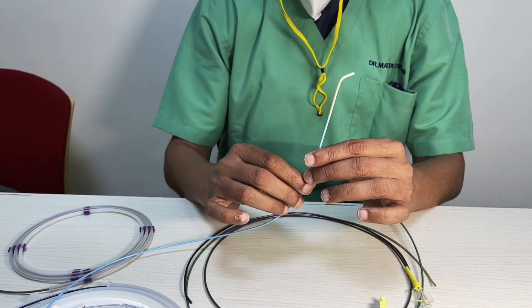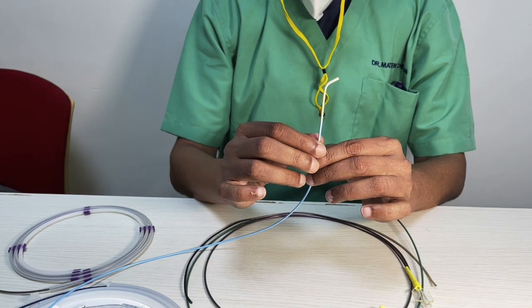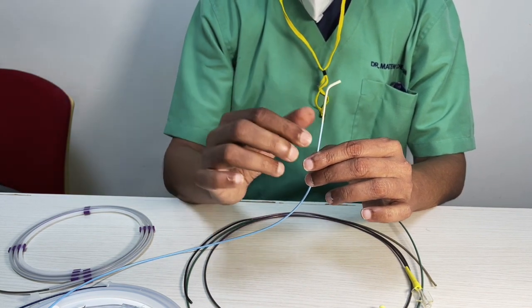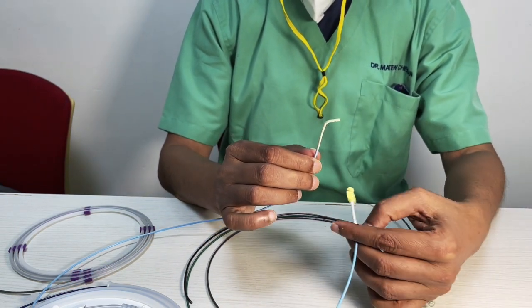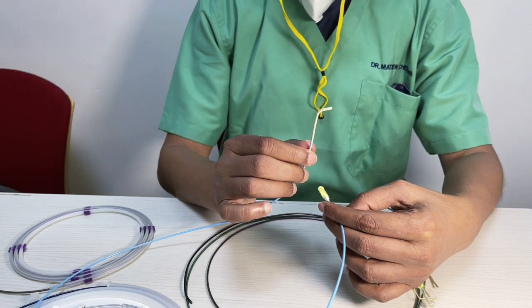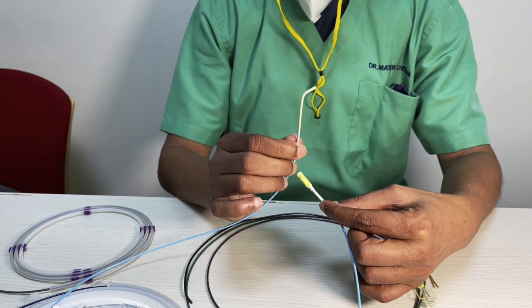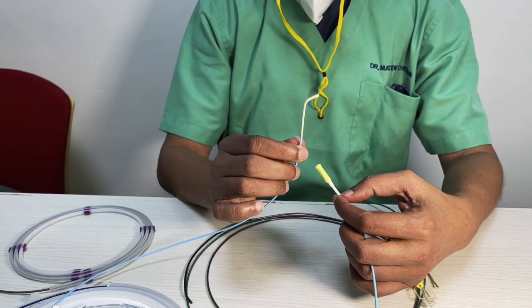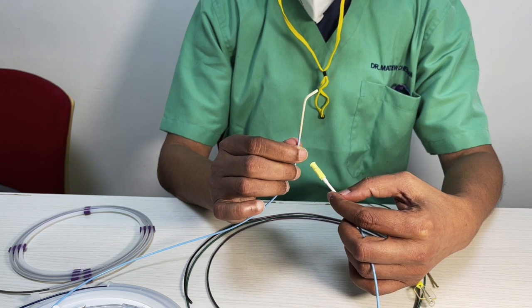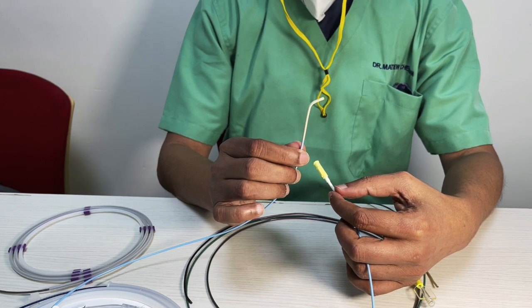So this was the limitation. You have a vessel which is very tortuous, and in a very tortuous vessel, you would like to cross all these bends so that our access is better. Having said that, why is it necessary to have a guiding catheter at all? Why don't we take a microcatheter right from the ostium of a vessel? Now, it's very simple if you understand the logic.